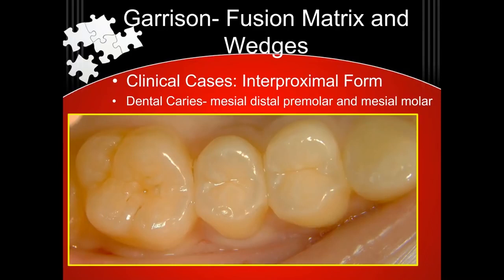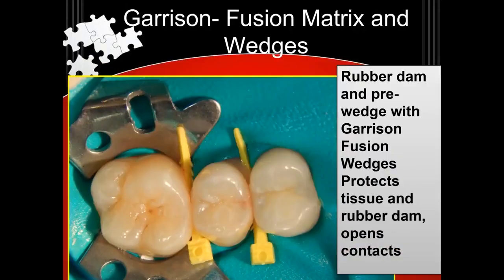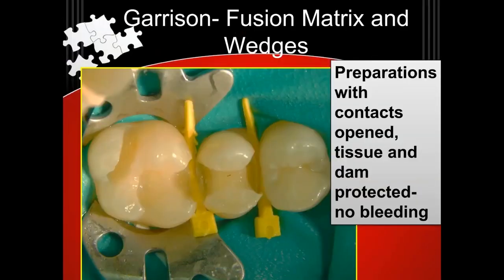It really does a great job of cleaning in between the teeth. And you can get anesthesia, then get your rubber dam on, and then do your pre-wedging — the same old thing. So you got your Garrison fusion wedges in, nice isolation, cut your preps. The rubber dam is retracted and protected.